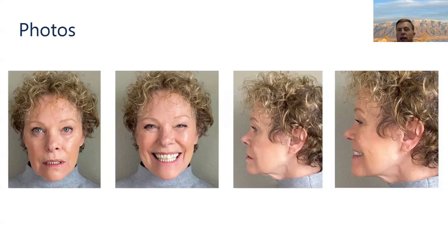We want to make sure when you're taking the photos that the hairs behind the ears, tops of the ears are between the eyes and the eyebrows, so that you get the right anterior posterior level, and that the interpupillary line is level relative to the camera. So once you get the right setup, you want to take a headshot with the Duchenne smile. Again, critical, you've got to see that high lip position. Do whatever you've got to do until you get that.